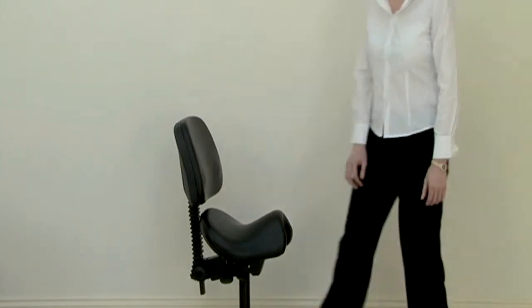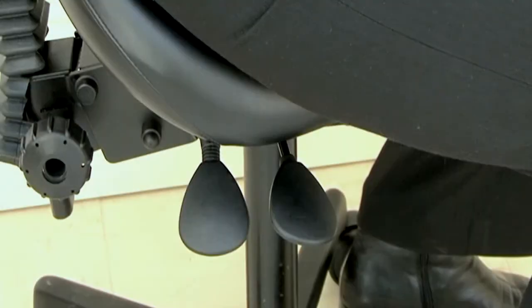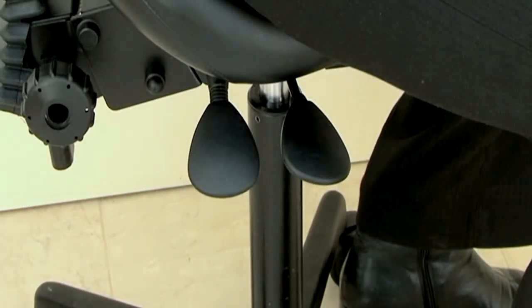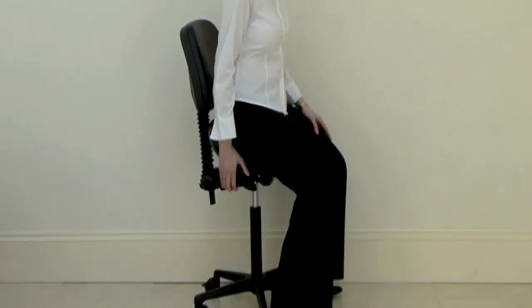To adjust the height of a seat with a gas lift stem, first ensure that the seat is in its lowest position. This can be done by lifting the front lever on the user's right hand side and exerting a downward force on the seat. To raise the height of the seat, the user must stand and take their weight off the seat before lifting the front lever on their right hand side.